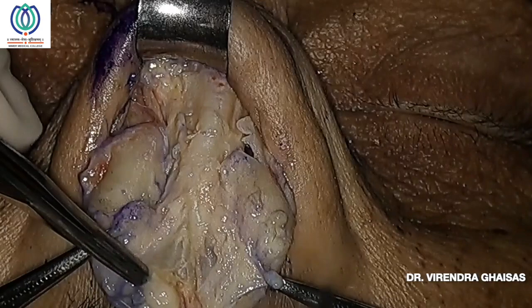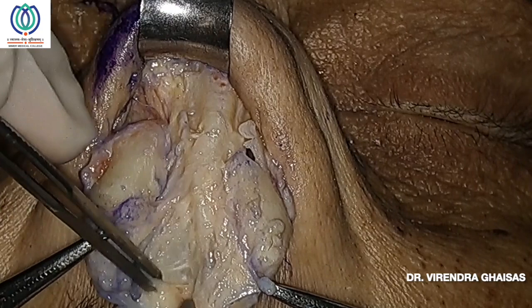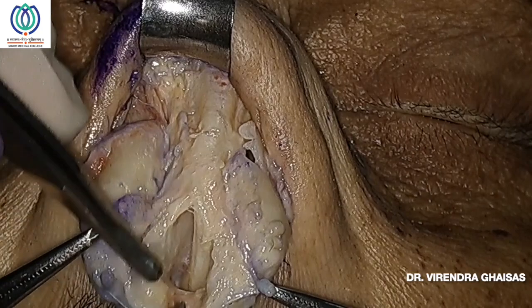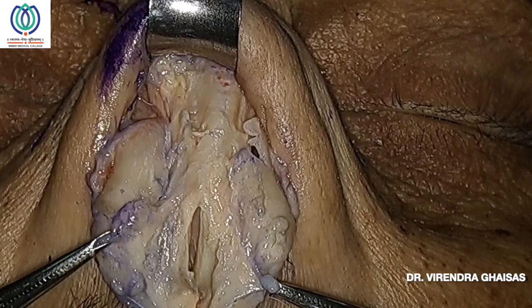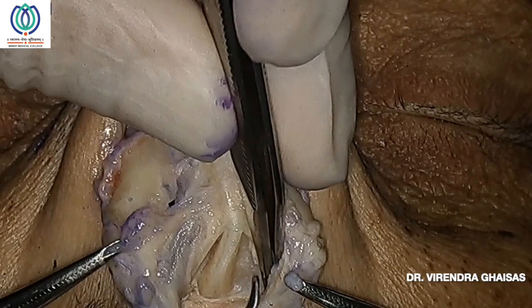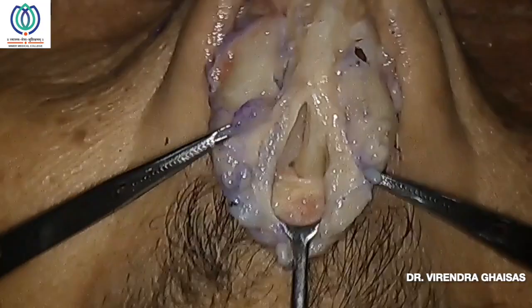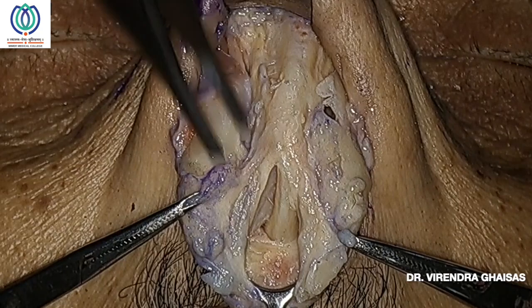So here you can see the perichondrium, where all the nutrition and the blood vessels are. So it's very important to have a subperichondrial plane to preserve this perichondrium to avoid a septal perforation later on. While elevating this, you can either cut the perichondrium with a knife, a number 15 blade, and then find a plane, or you can do it with the sharp edge of a scissor.